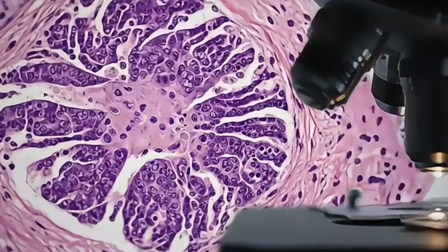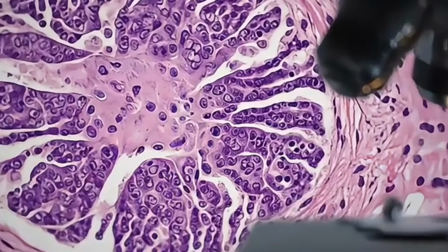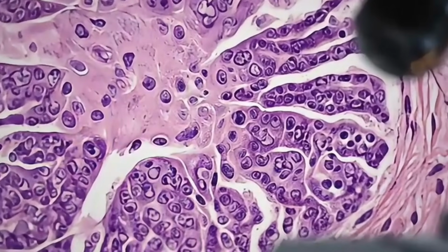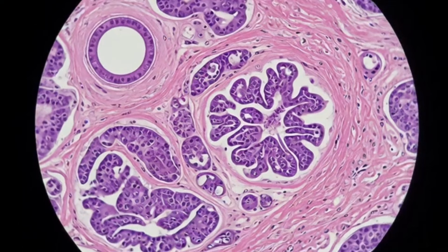At this magnification, the overall architecture begins to disappear, and the individual structures become much easier to recognize. Take a moment and look carefully. Do these glands look like the normal ducts we saw earlier? Not quite. Normal breast ducts are smooth, round, and evenly shaped.